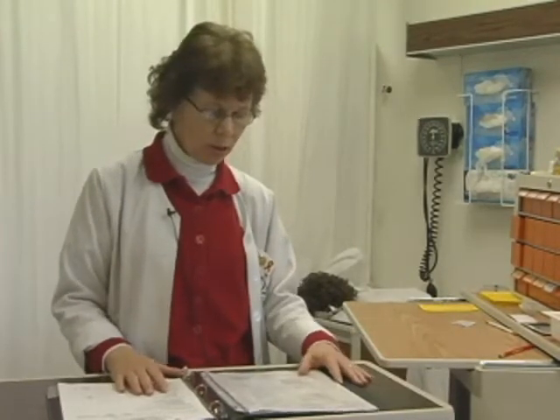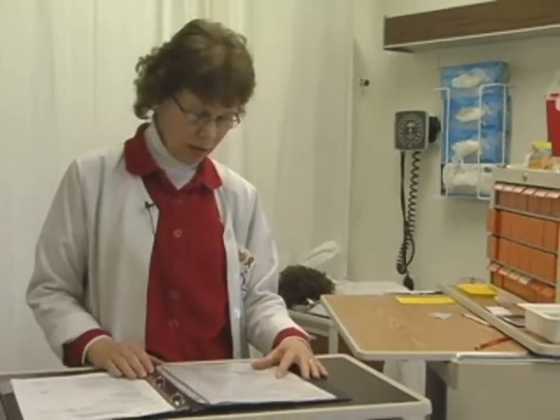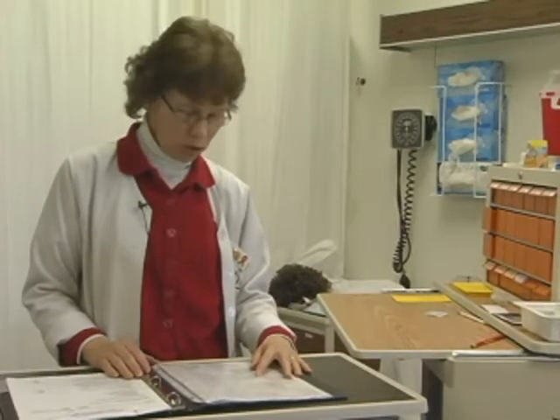Today we're going to show you how to give an IV push medication through an existing IV line. So I have my MAR here, and I'm going to check the MAR for the patient's name, Harmon Wagner. The medication, Zofran. The dose is 4 milligrams. The route is IV push, and the frequency is every 4 hours as needed for nausea.